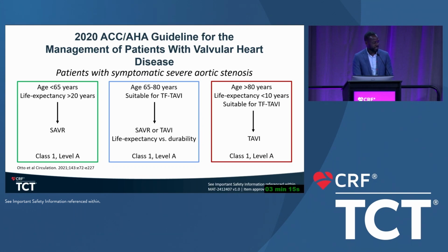Yeah, but Keith, we are putting a lot more patients who are younger, in their 60s, and I would venture to say that a 65-year-old who's already had valve disease, severe AS, probably has some predilection to having coronary disease by the time they die over the next 25 to 30 years. And so Keith, I worry about it a lot. I mean, you can't just say PCI.